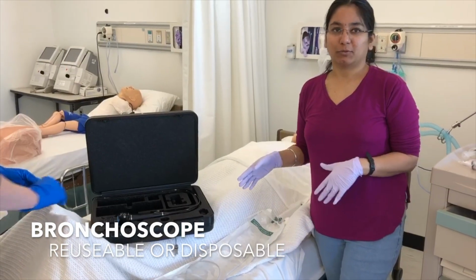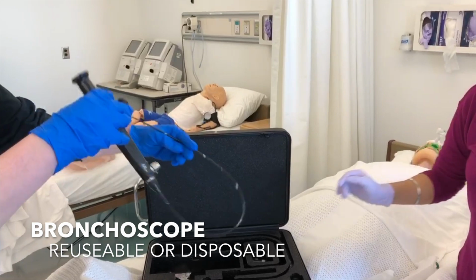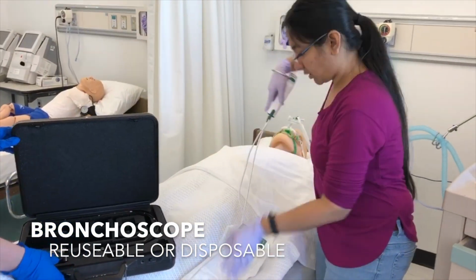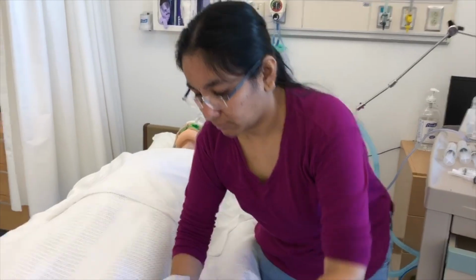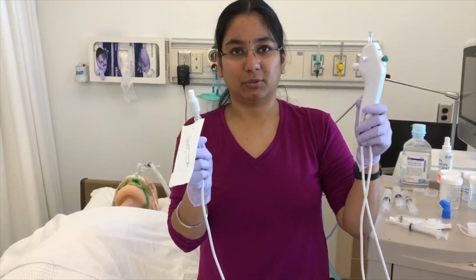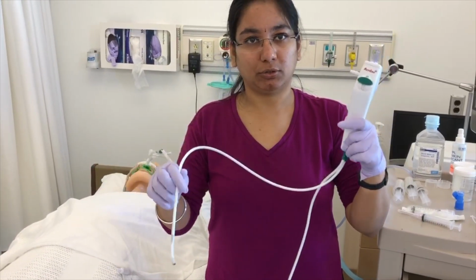There are two types of bronchoscope. One is a reusable bronchoscope and the other one is a disposable bronchoscope. This is a disposable bronchoscope where one end is connected to the monitor and the other end is inserted into the ET tube.